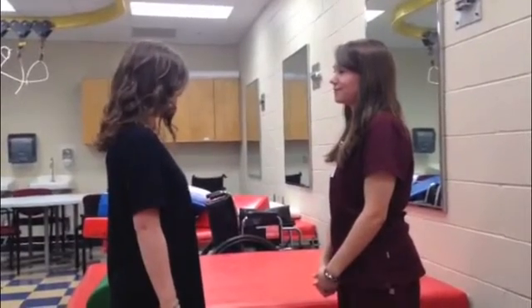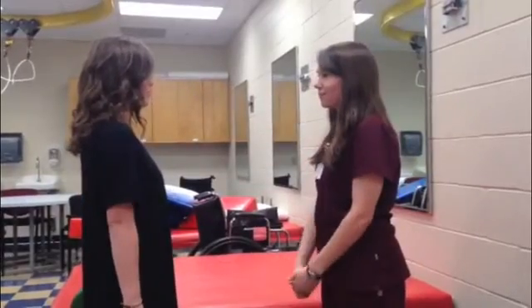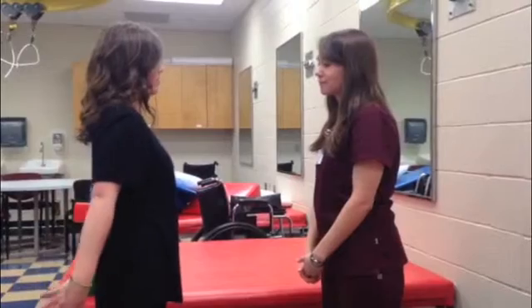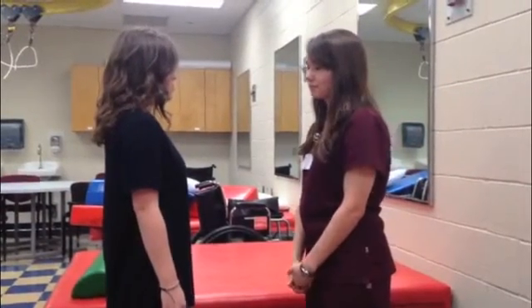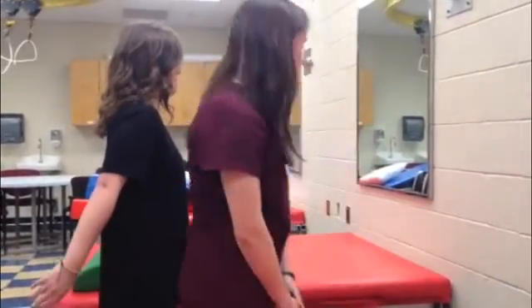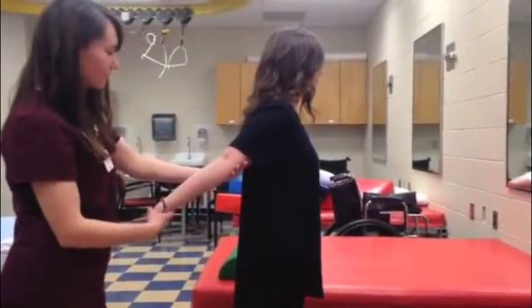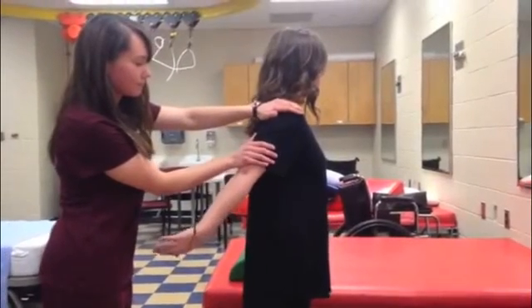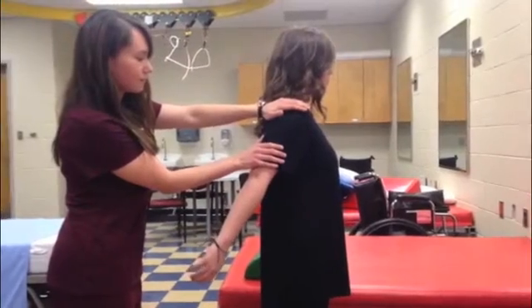To measure shoulder extension, the patient should be standing upright. Ask the patient to actively raise the shoulder backwards. As the patient performs this motion, watch for any muscle contraction, signs of exertion, and any abnormal substitutions. If the patient can perform the motion, ask them to raise their arm to about mid-range and hold it there. Stabilize the shoulder proximally and apply resistance distally at the elbow without crossing the joint. The muscles acting in this motion are triceps brachii and posterior deltoid.